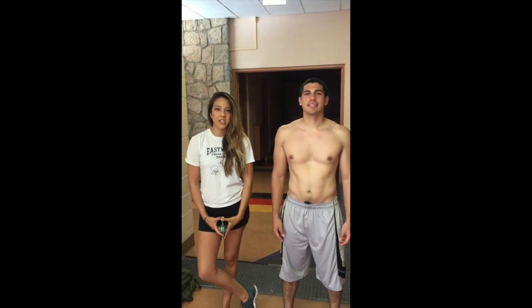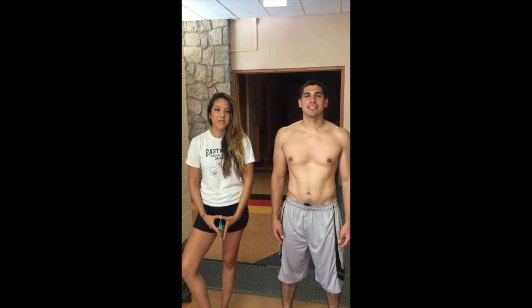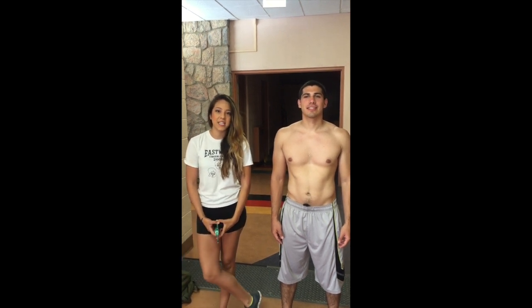Hello, my name is Jessica Hernandez, and I'm going to be demonstrating skin fold testing according to the ACSM guidelines.